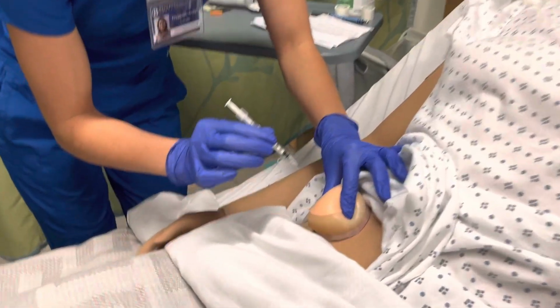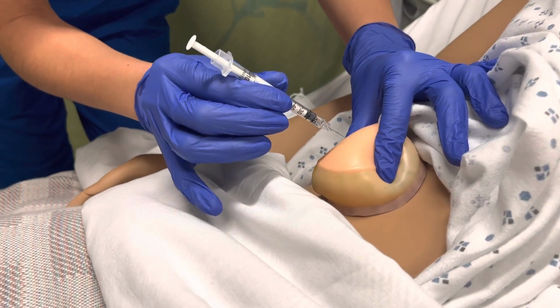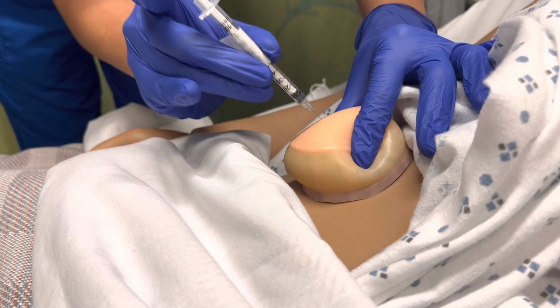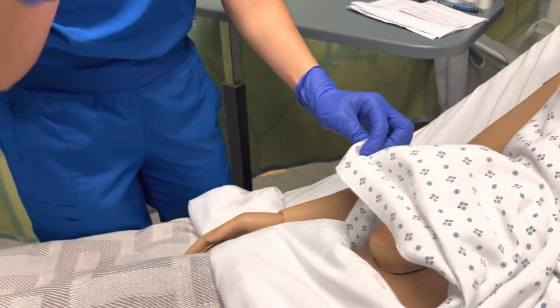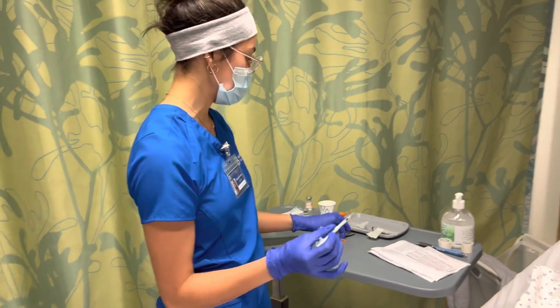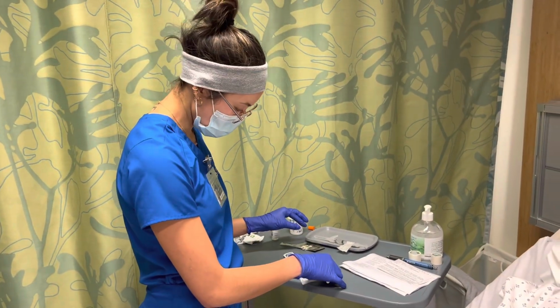I'm going to pinch and pinch, going at a 45-degree angle. And then I would put this in the sharps container, but for us, we are recapping.